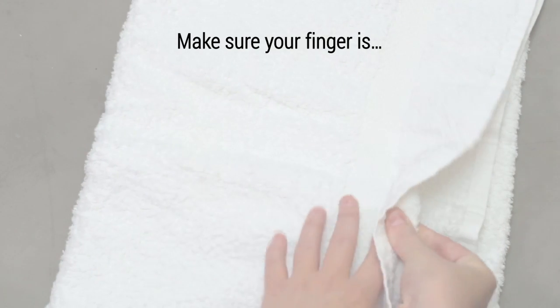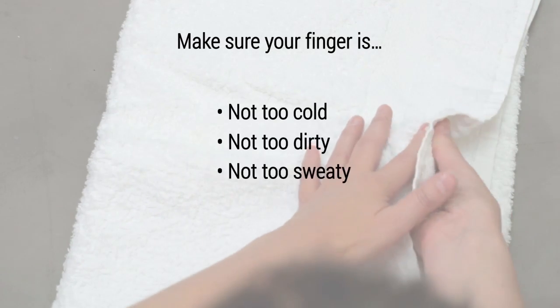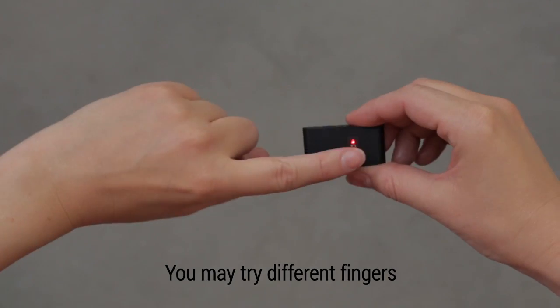Make sure the finger you press against the Pulse OX is not too cold, not too dirty, not too sweaty, and free of calluses. You may try different fingertips if necessary.